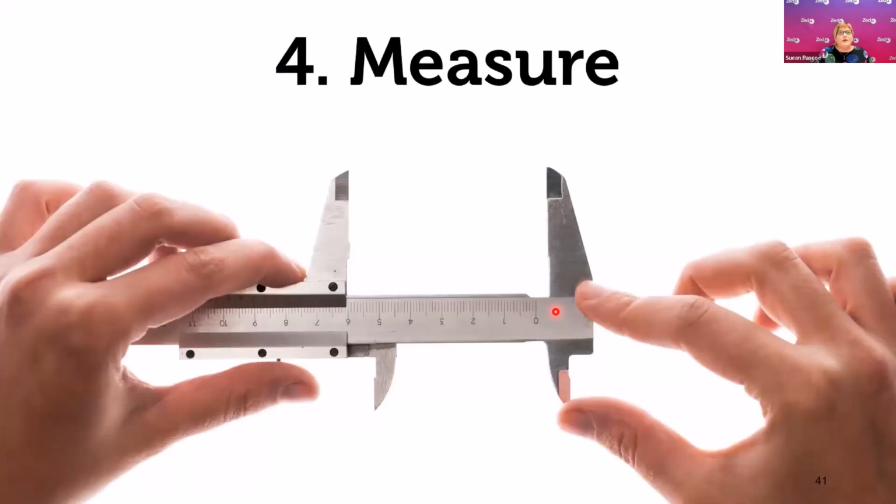Now, after we've done our very thorough search for the foreign body, and look, sometimes that can take a little while, as I mentioned, you can go over the area a number of times, try a couple of different angles. It can be really tricky to find them, but it's really important that you use a very systematic and thorough technique and do a crisscross pattern to try to cover the area in both planes.